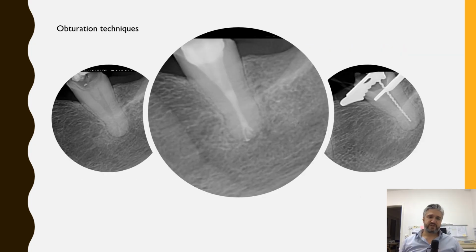So we talked about the sealers and a little bit about nanotechnology. In fact, nanotechnology is still keeping researchers busy, actively exploring the properties of many materials that can be used in the dental industry. They are investigating the development of certain properties of these materials, such as solubility, antimicrobial effectiveness, and durability. They are going to remove the expensive sealer from the market and replace it with material that is less expensive, easy to use, with better properties, and, as I said, cheaper for the end user, like the dentist or, in the end, the patient.